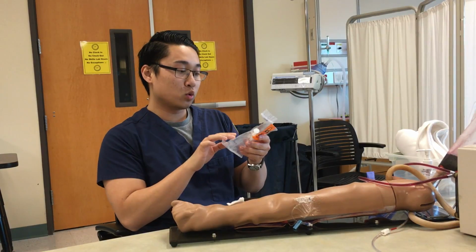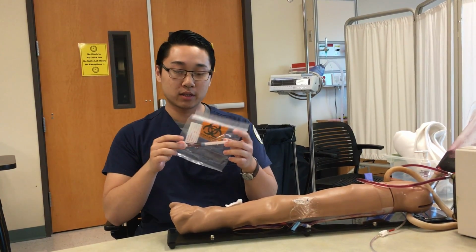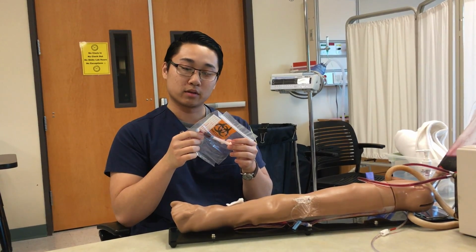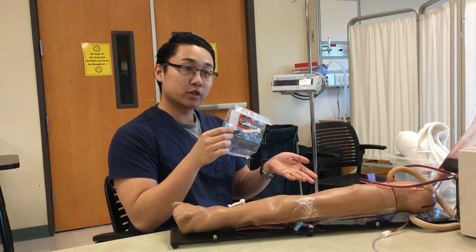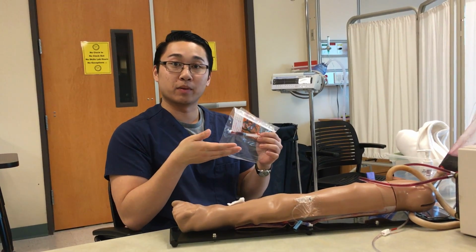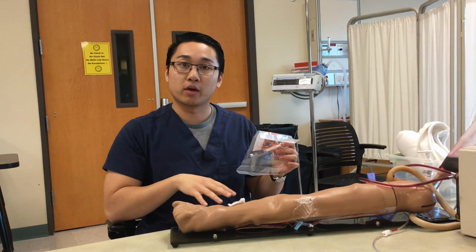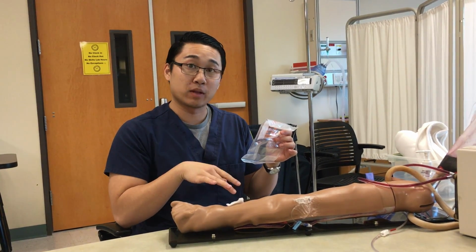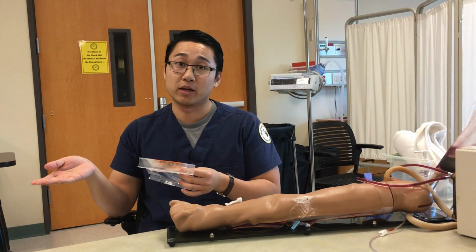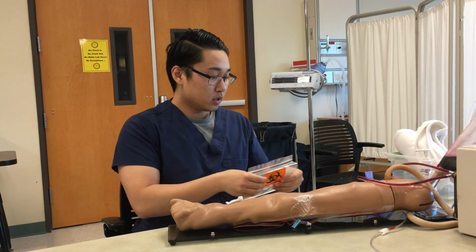So now I'm going to go and analyze the blood gas. I'm going to get the results back. I'll interpret the results, and I will make a modified plan for the patient as needed. Now I'm going to chart my findings and my plans, and I'll report it to a person that needs the information, such as a physician or a nurse or another RT.